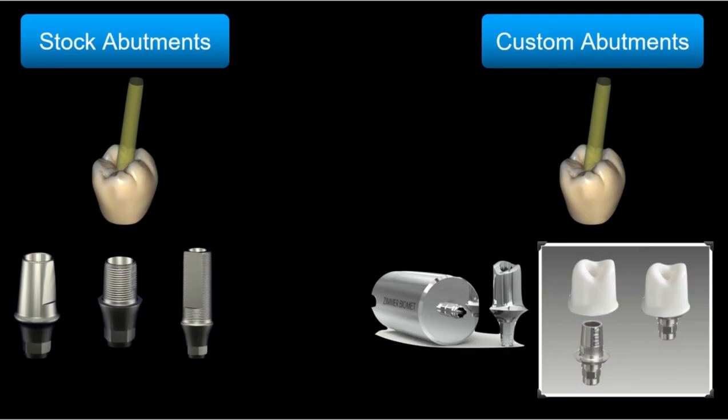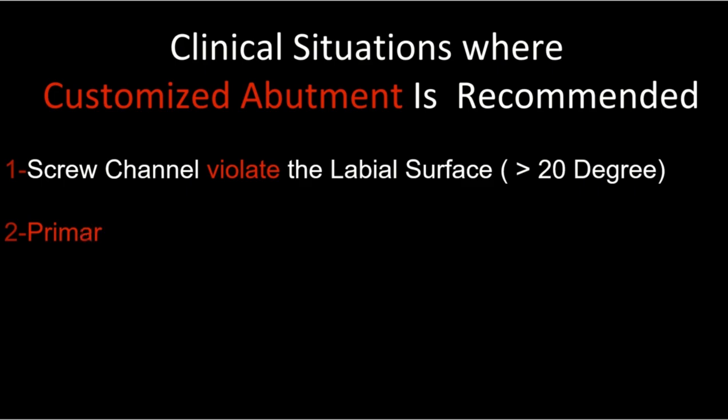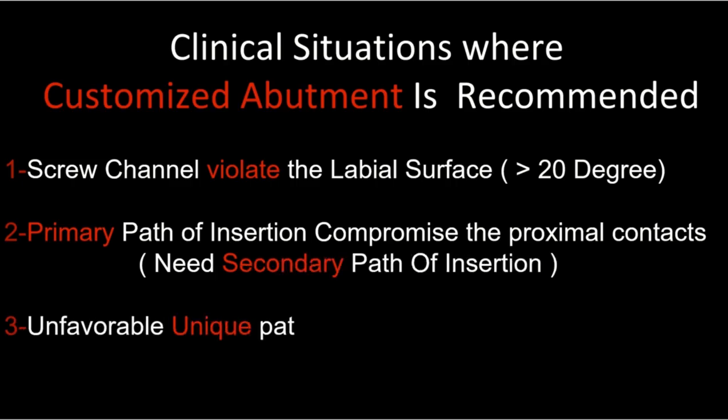So we have two options: your crown glued directly on your substructure like a Ti base, or you will make a custom abutment first and then your crown will be glued over this custom abutment. In all cases, take the easier and the shortest method. I mean here to glue your superstructure directly over the stock abutment or Ti base. But in some scenarios, you are obligated to customize your abutment. I will summarize the three scenarios in which you usually have to select the custom abutment choice.